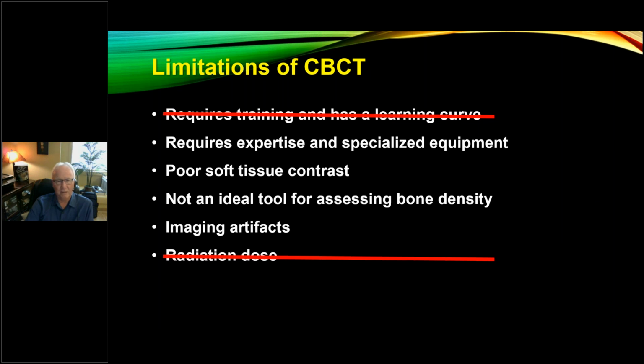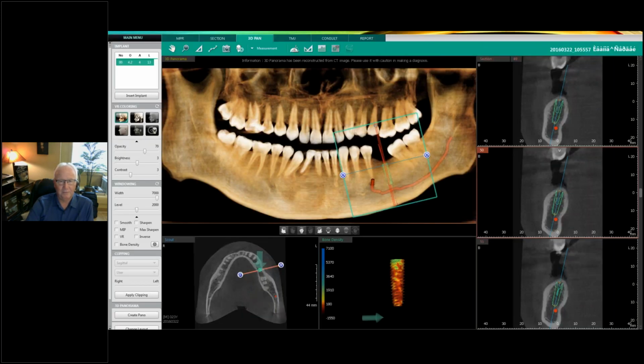If you've got a great piece of equipment that helps you do good surgical dentistry, then you need to use it. You're not irradiating areas that have that many tissues that have sort of high radiosensitivity. Parotid, yes. Thyroid, yes, but not in adults. Brain tissue is relatively radio insensitive.